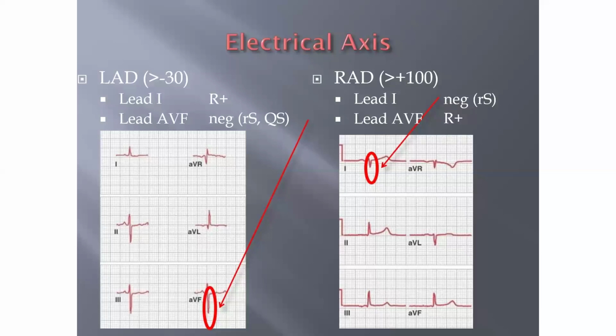Wolff-Parkinson-White syndrome is a congenital anomaly a patient is born with. They have extra pathways in the atria, normally shown by something called a delta wave. When you look at your QRS, the upstroke looks like a delta, like a tick. That is WPW.